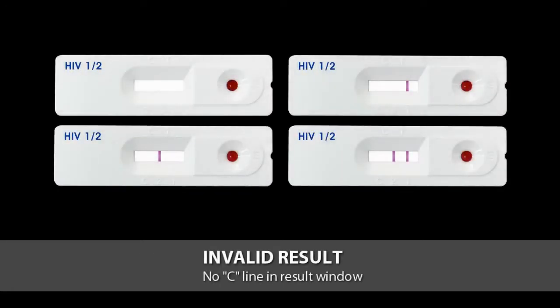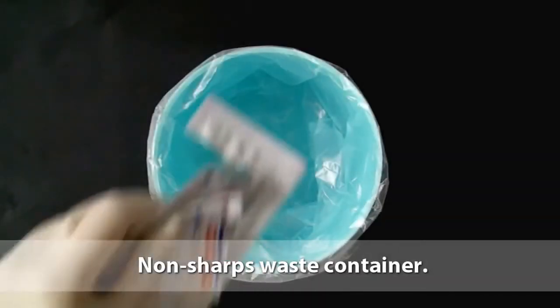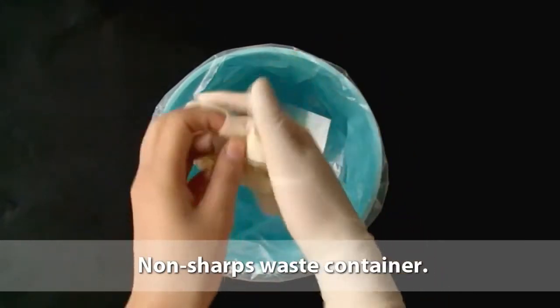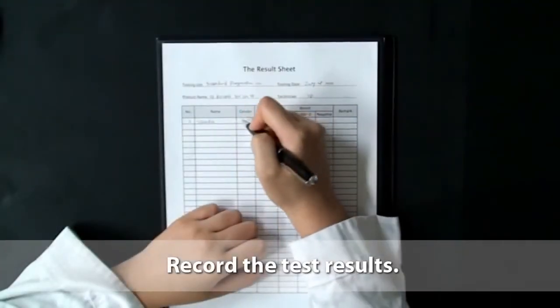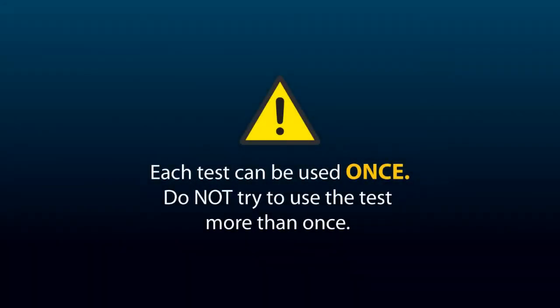If no line appears near the letter C, conduct the test again with a new test device and a new disposable capillary pipette. Dispose of test materials such as test device, gloves, alcohol swab, desiccant, and packaging in a non-sharps waste container. Record the test results. Now remember, each test can be used once. Do not try to use the test more than once.